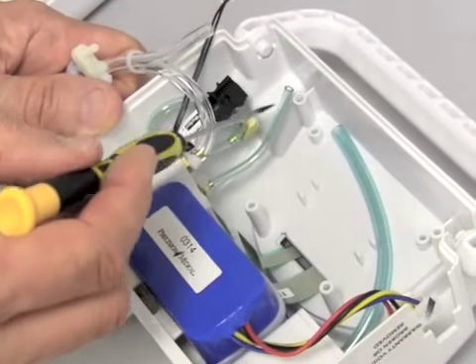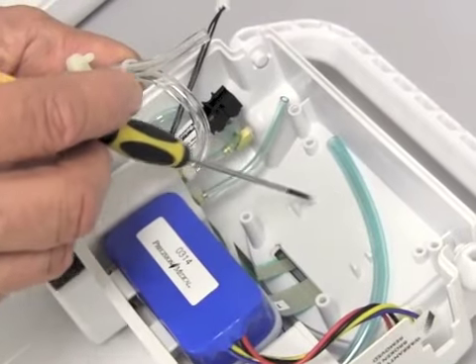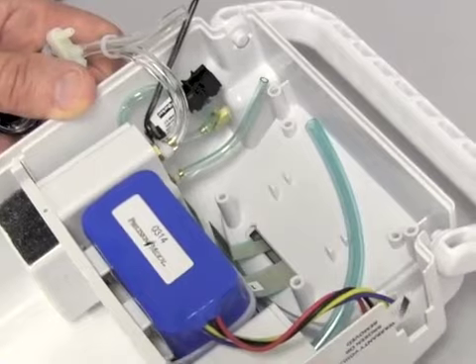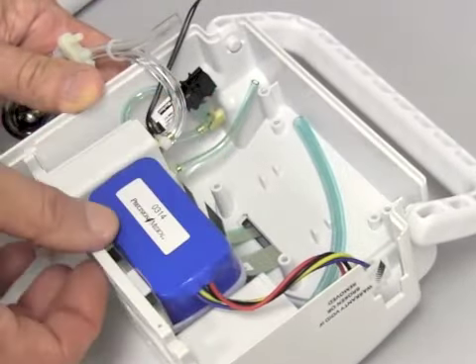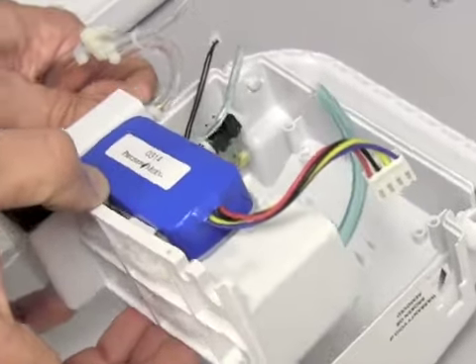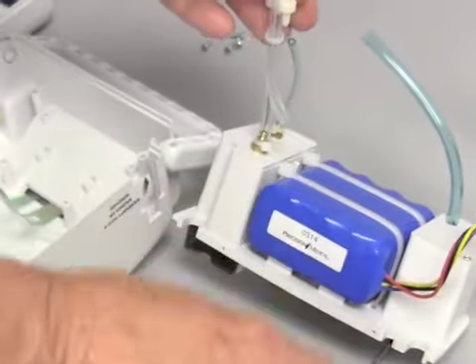This shows that I have disconnected the Tygon from the valve, and have also moved the Tygon out of the slots on the POC. Now we're ready to remove the reservoir assembly from the POC. And all you have to do is pull gently upward, and the whole reservoir assembly with the battery will be out.